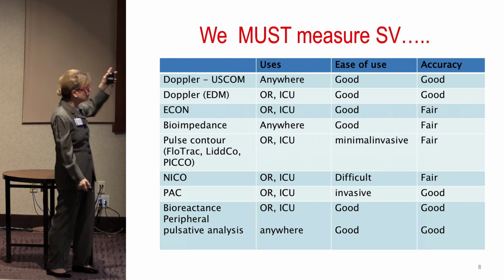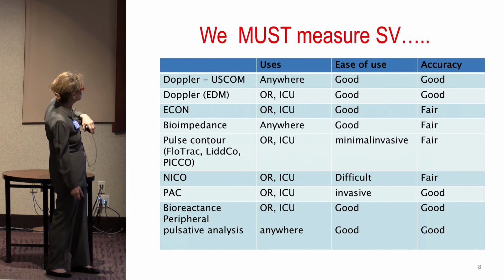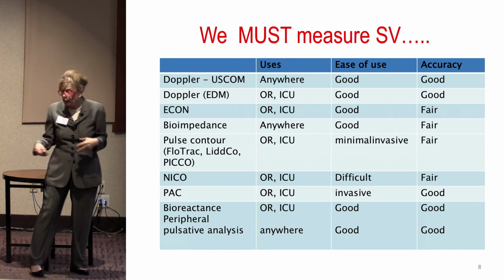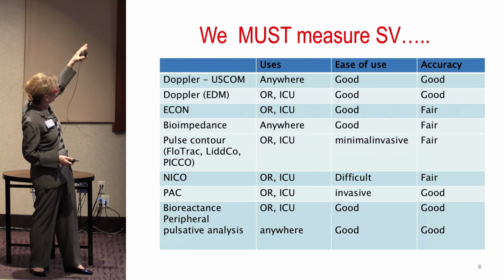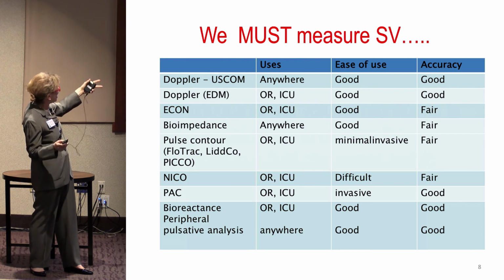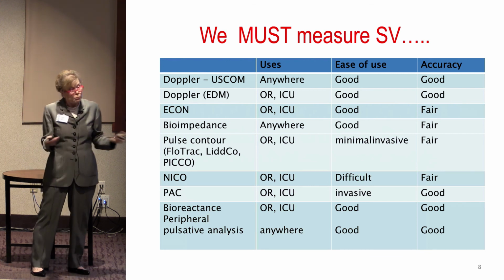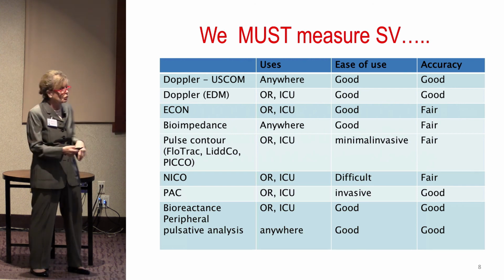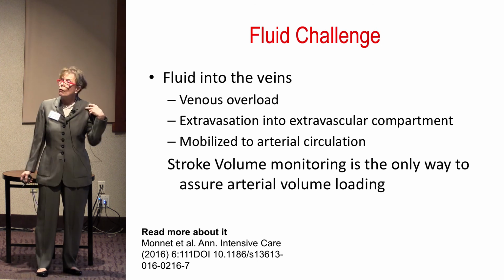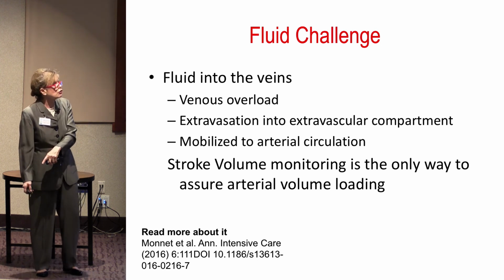So there are lots of different methodologies, just a basic comparative analysis, talking about invasive, minimally invasive, maximally invasive. What we just want to remind ourselves is that in general, everything is good. We have a few things that are fair, but in general, everything that we're using and comparing is pretty good, and our methodologies are really going to be based on what we have available to us at our hospital.